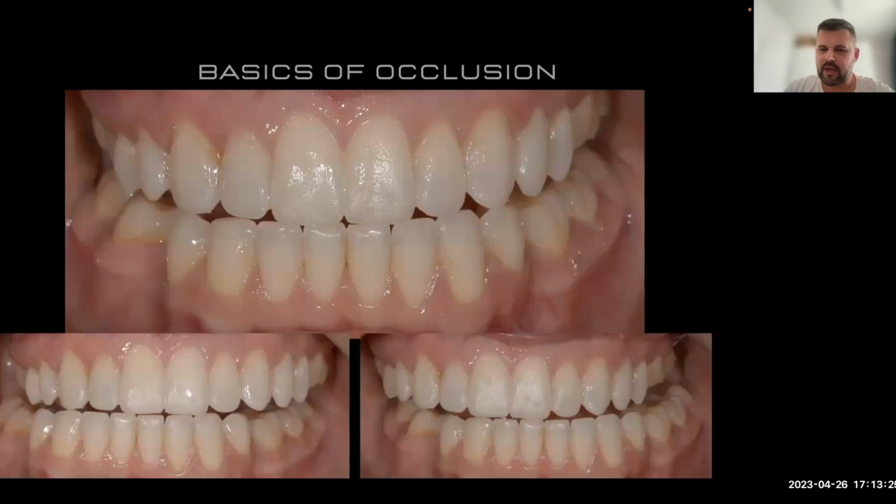But when we see contact on the laterals, I know there is a chance for chipping. So maybe in the future there will be a problem. Also, when you look at the lateral movements, you will see there's no guidance on the canine, so the contact is only on the incisor. So there will also be a problem in the future, I think, with chipping. So there's a problem for me and for the patient, because I always try to explain something like that to the patient.